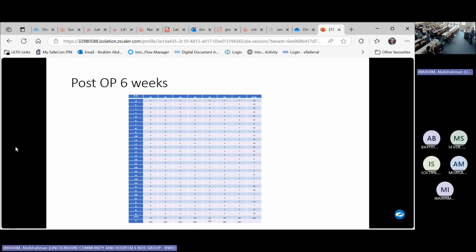And this is one of the crucial things, expectation to deal with patients. This is why people say eustachian balloon dilatation is not working all the time. Yes, because it takes time and not all the symptoms improve. You can't guarantee which symptom will improve with the patient.